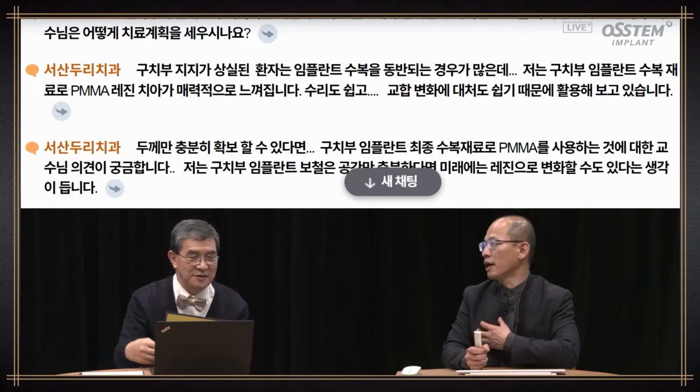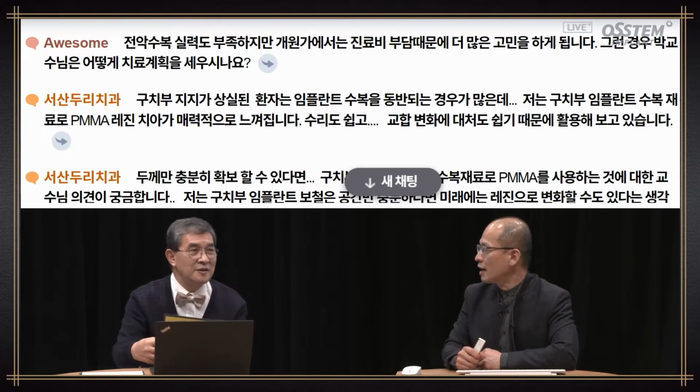PMMA resin, well, as a permanent, I don't have experience, so I cannot really talk about that. But I believe the question was asked because PMMA is densely packed for the CAM purposes, right? Yes, hybrid PMMA probably. So for evaluation, it could have meaning, whether it's correct or not. I think the question was asked because it's easy to respond to the occlusal changes. So it's very good for evaluation. Yes, using for milling, right? Yes, I don't have much experience, so I don't use that much.